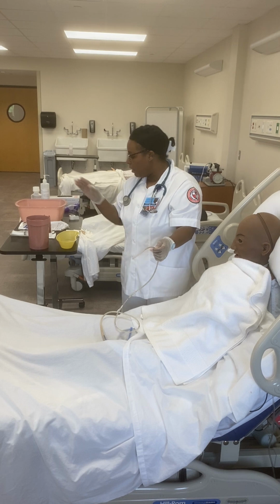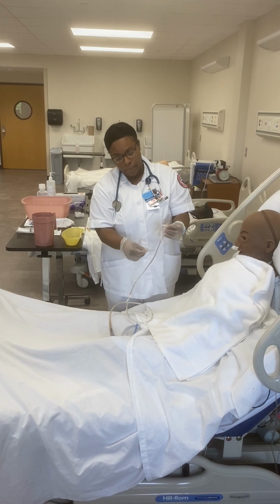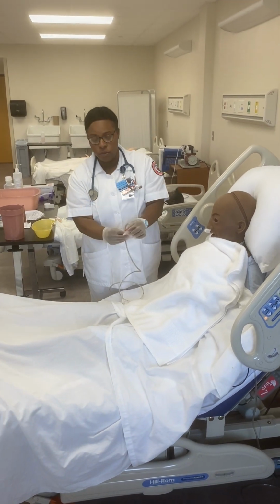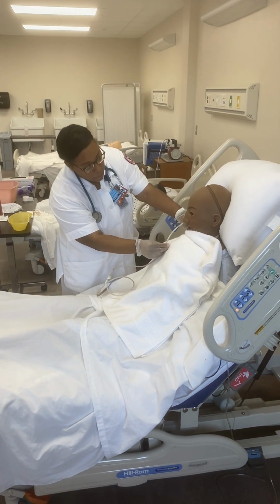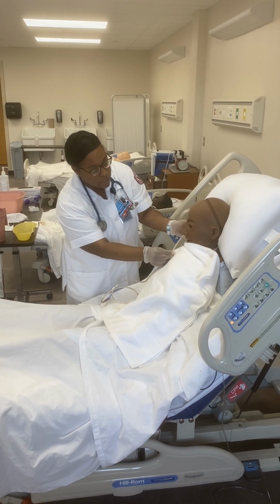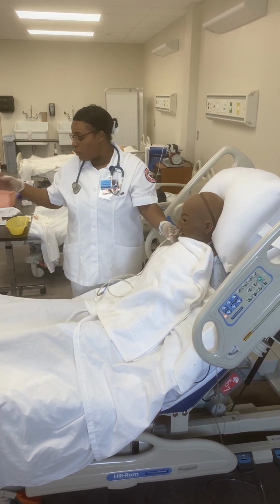After marking, I'm going to lubricate 3 to 4 inches of the tube with a water-soluble lubricant. Now I'm going to insert the tube in a backward downward position, asking my client to tilt the head chin to the chest and asking them to swallow water to help facilitate the insertion of the tube if they're able to swallow.